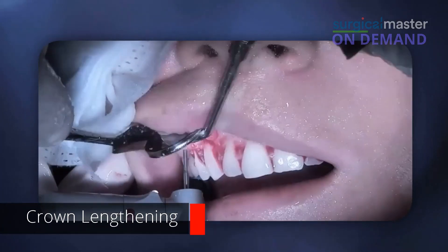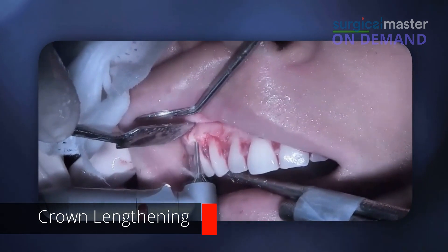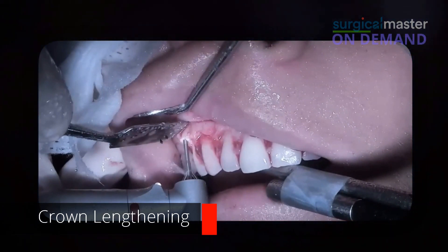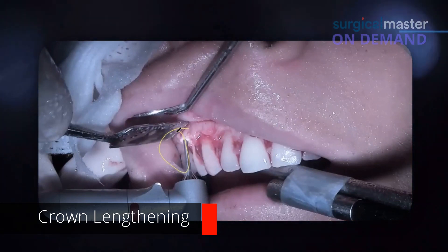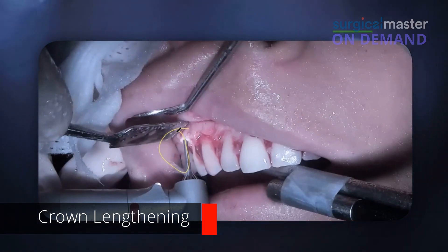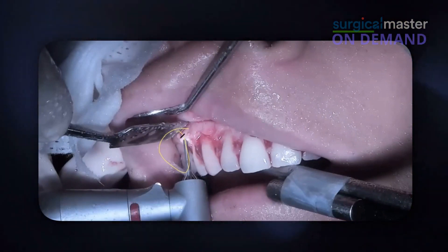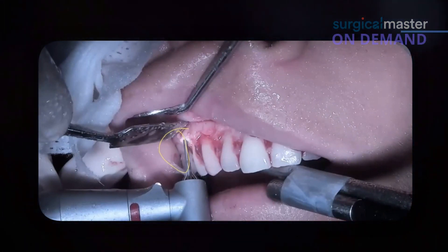I know I've limited the flap — you can see my flap is kind of restricted here. I want to stop and explain because this may be confusing: this patient has an implant and an implant crown here. I'm not doing crown lengthening where the implant is — we don't want that. The tooth was replaced without thinking the patient would need crown lengthening later, so the implant is at a certain level. That's why I'm limiting my flap here — otherwise I'd open it all the way.